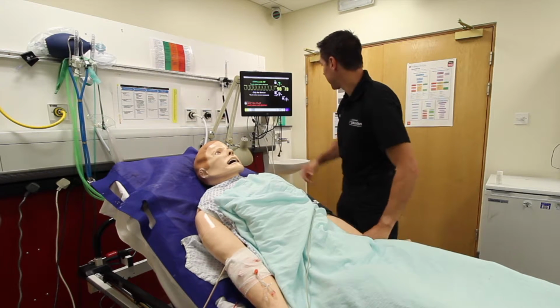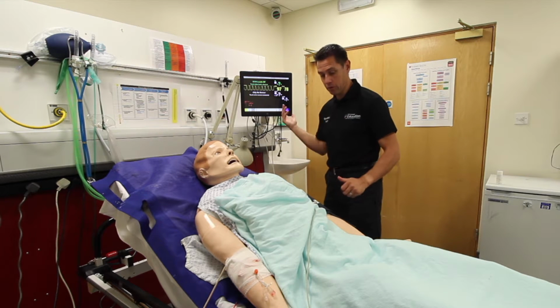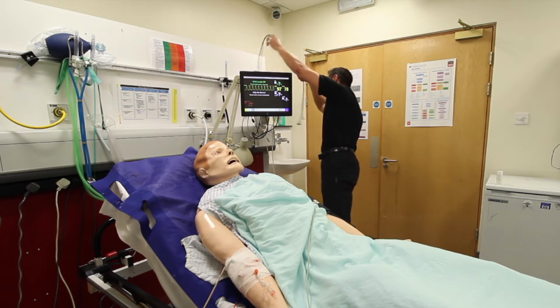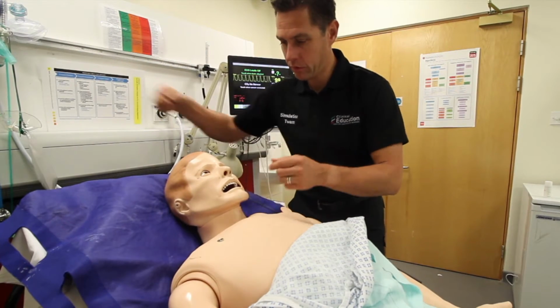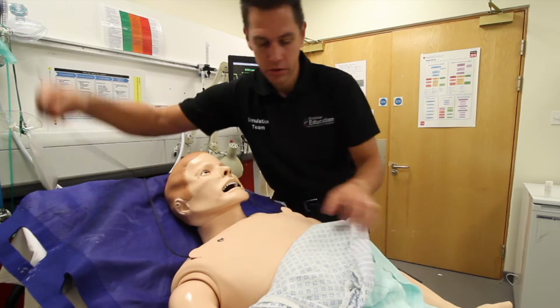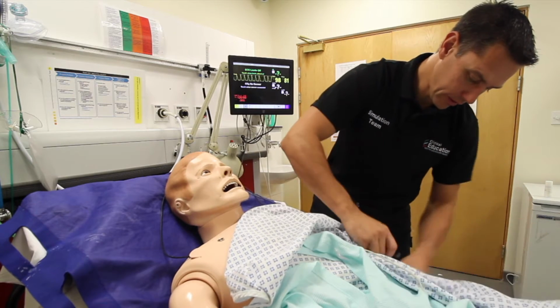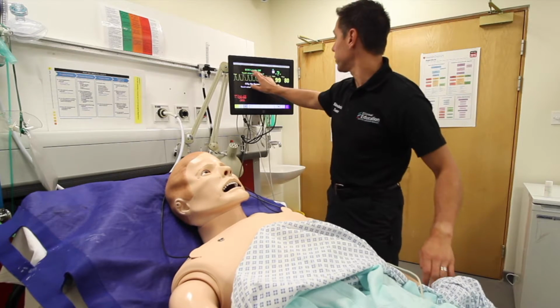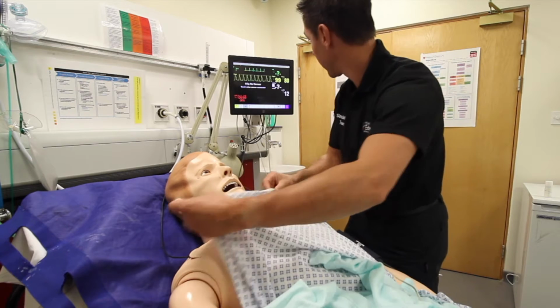And then once that's connected, I touch the screen, and then I'm going to press the start-stop button. And the blood pressure will come up in its own time. While that's going, I'm just going to pop some ECG leads on his chest. So, usual configuration. Ride your green bike if you've got 4 leads. That one just pops on down the chest down there. And then you touch the screen and the ECG will come up on the screen there. So that's got our monitoring up on there.